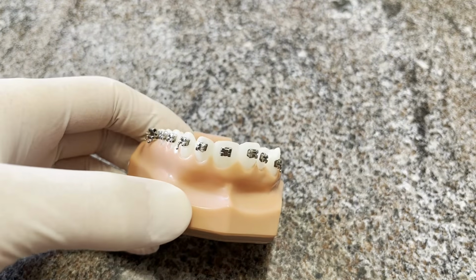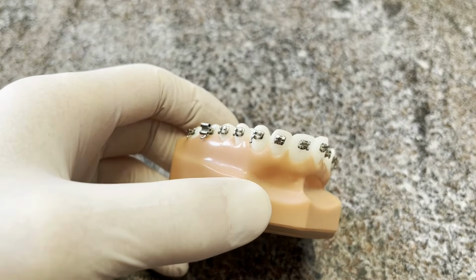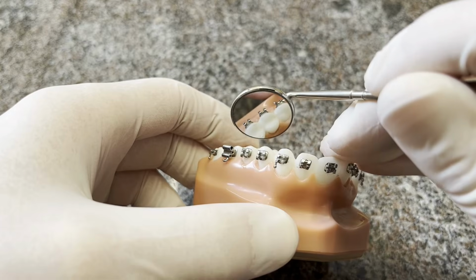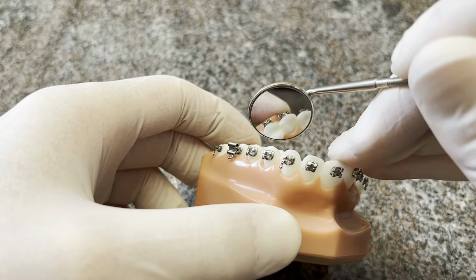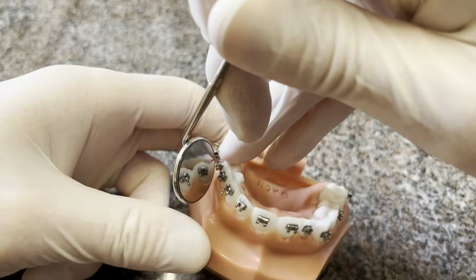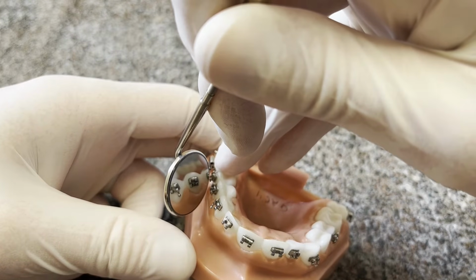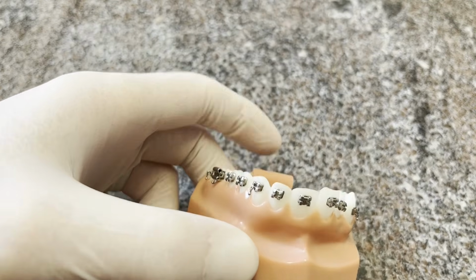So then the top brackets are the same. You'll place the 4s and 5s. You'll check it by looking in the mirror to check for rotation. You want it straddling that height of contour. You'll check it from the buccal like this to make sure that the slot is parallel to the imaginary line connecting the distal and mesial marginal ridges. And then you move on to the 3. You'll position the 3.